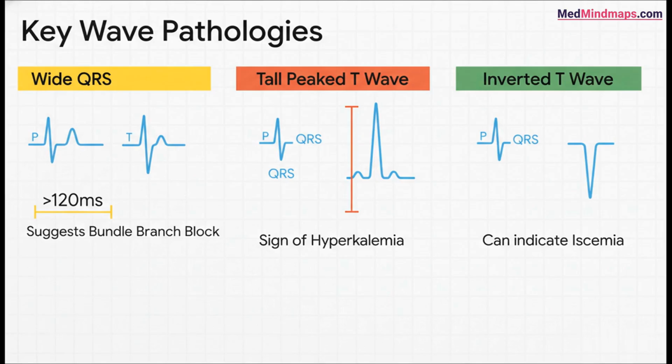That's the ventricles recharging or repolarizing. Watch out for tall peaked T waves. That's a classic sign of high potassium or hyperkalemia. And if those T waves are flipped upside down, that could mean ischemia.